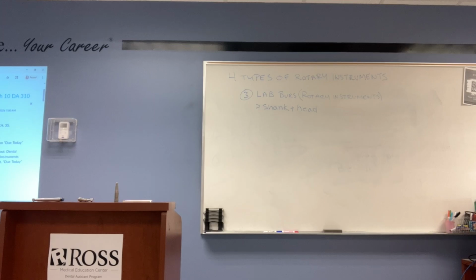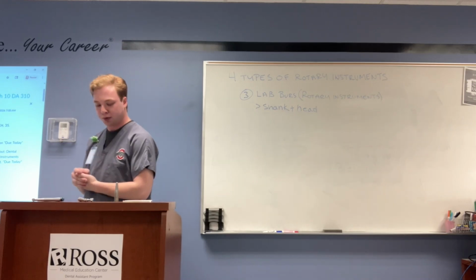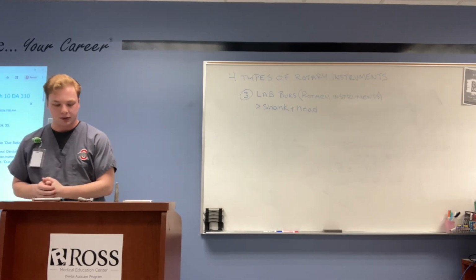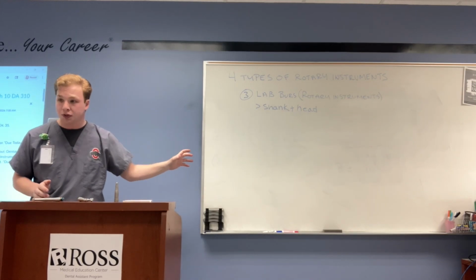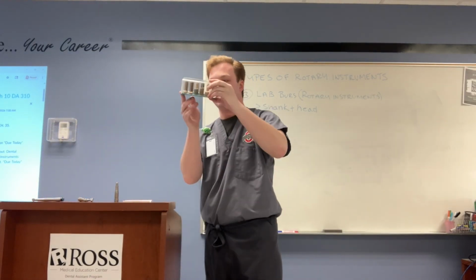So I want you guys to look. This is an example of the laboratory burr. It's a lot more heavy duty, and you can tell it apart from any clinical burr you might use. It's a lab burr. So we had our diamond rotary instruments, our finishing instruments, lab burrs, and then we have these, again, these abrasive instruments.